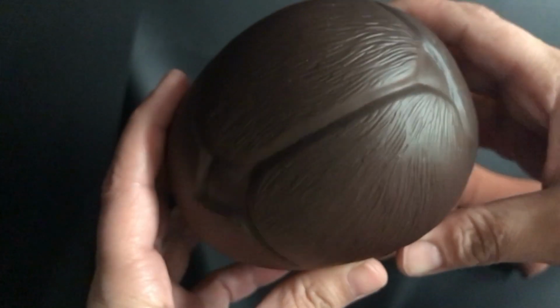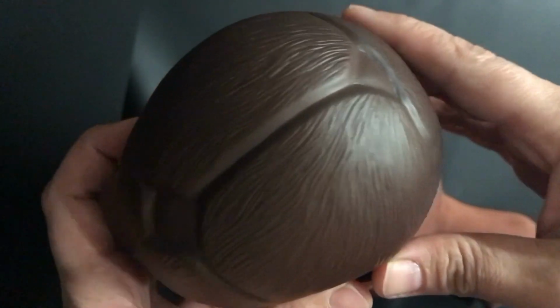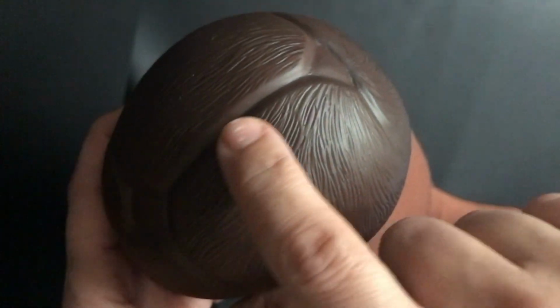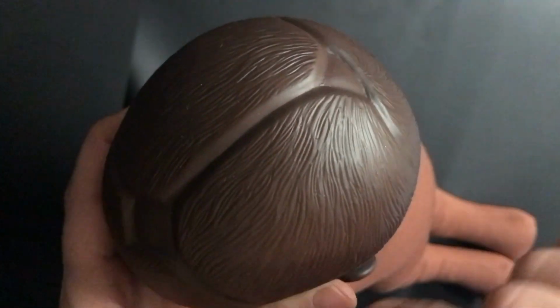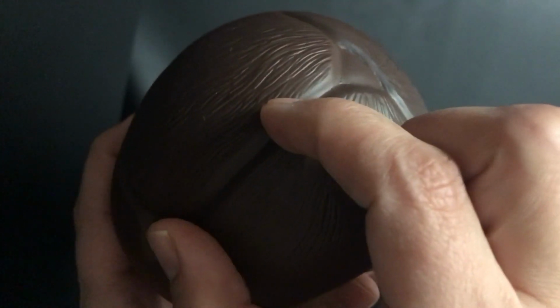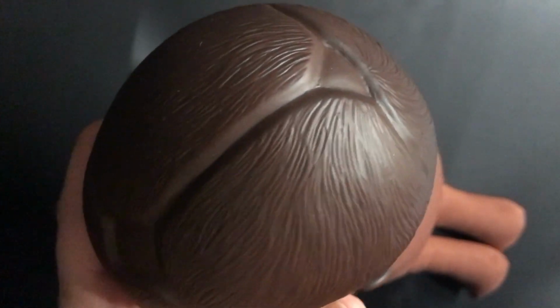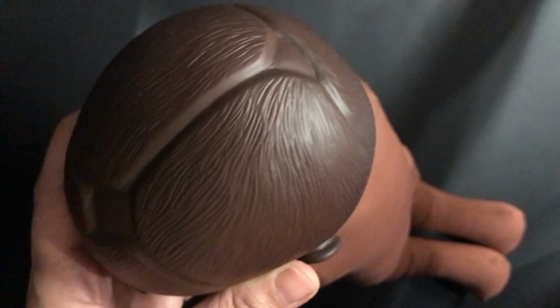As you can see here, this is the fetal head and this is the sagittal suture. These are the two fontanelles. This is the posterior one and this is the anterior one, with the sagittal suture in between. As I told you, we divide it into two parts, 3 and 6 centimeters, and the flexion point will lie here exactly. Okay, so let's have the cup.